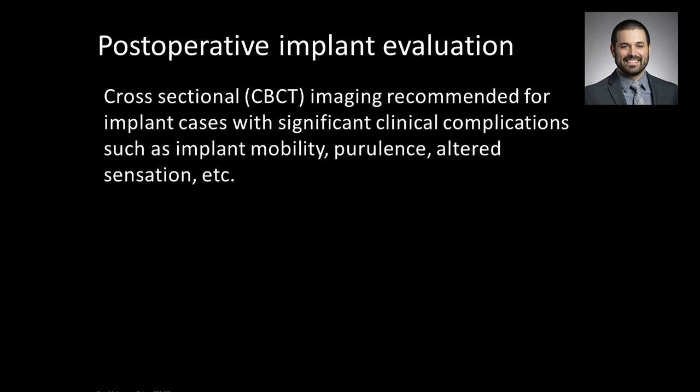So our recommendation is, if you have a patient with an existing implant with symptoms or any sort of clinical complications, be it mobility, purulence, altered sensation, et cetera, do order and acquire the cone beam CT to get a 3D assessment of what might be going on. I also still advocate for the single periapical to get that one image without a lot of artifact, to see that mesial and distal bone. The combination of the two in many cases can clarify what might be going on with that particular implant.